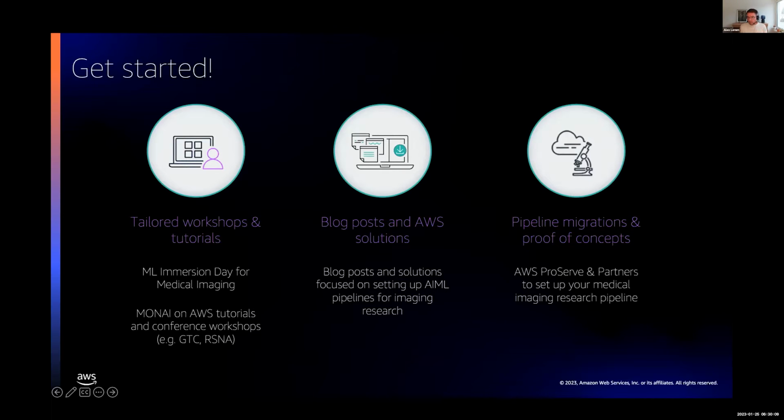The final date is not yet decided. In this 3-hour workshop, you will touch all of the MONAI components, starting with MONAI Label, MONAI Core, and the 2 MONAI Deploy components on AWS end-to-end using a single example, so a single data set.